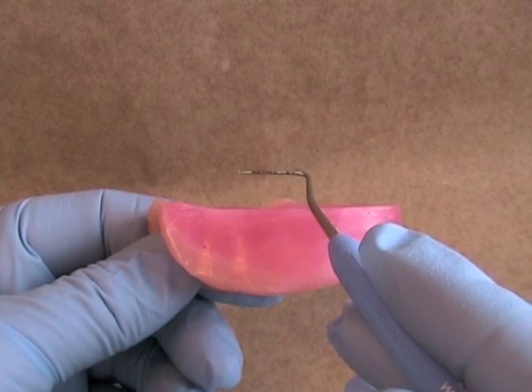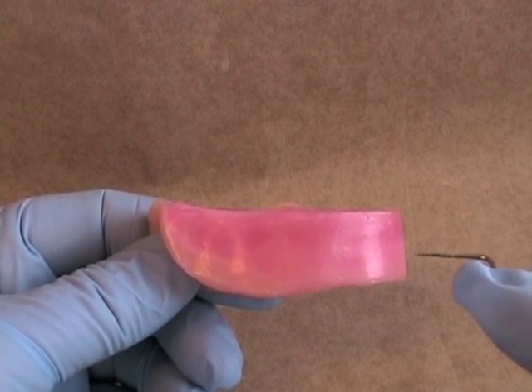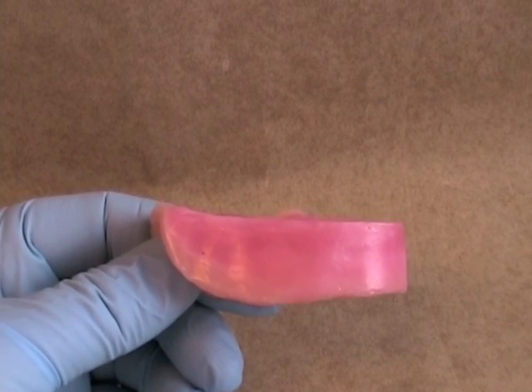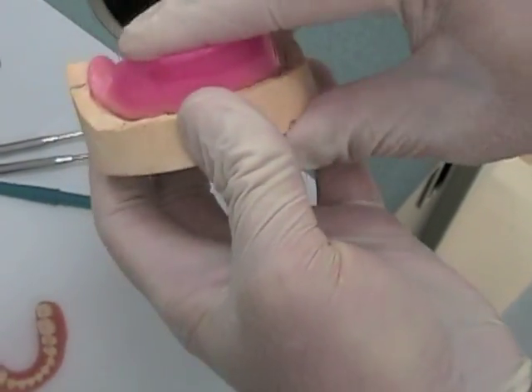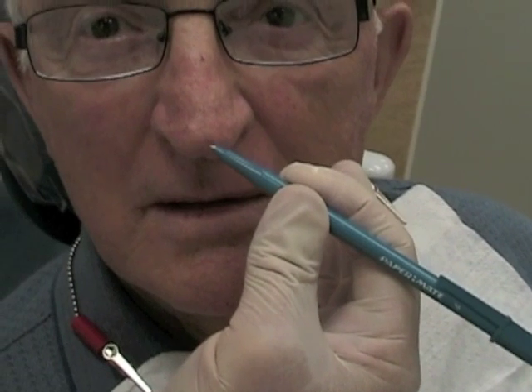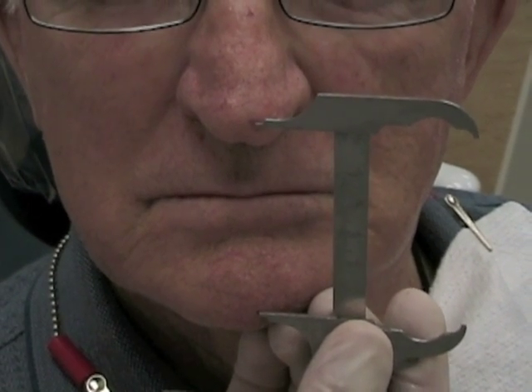If the occlusal plane is too low, the patient's tongue will lap over the top and the patient will accidentally chew their tongue. If the occlusal plane is placed too high, the patient's tongue has to move up higher to replace the bolus of food on top of the occlusal table during chewing, and the patient will fatigue and report a sore tongue. We mark halfway up the retromolar pad, transfer it onto the land area, reseat the wax rim on the cast, and use a pen or ruler to verify alignment. Then we put discreet dots on the patient's chin and the tip of their nose to use a Boley gauge for measurements of both physiologic rest and occlusal vertical dimension.